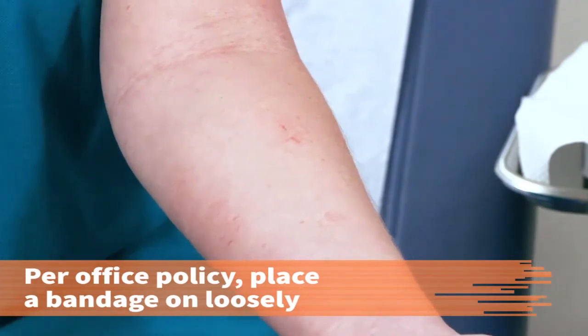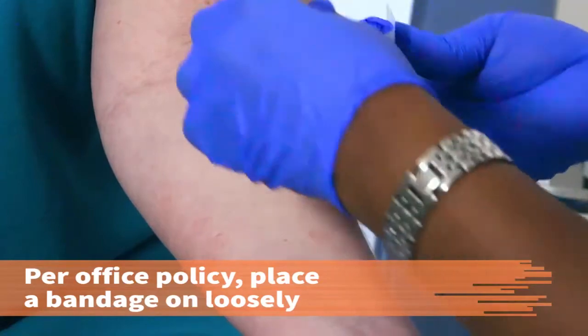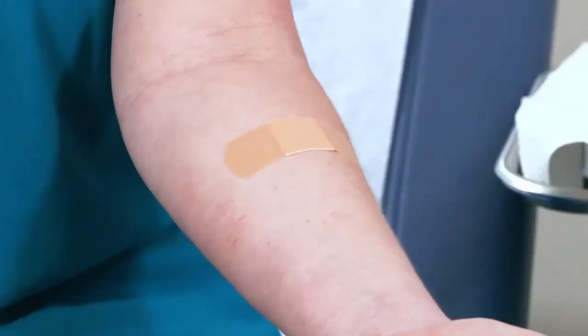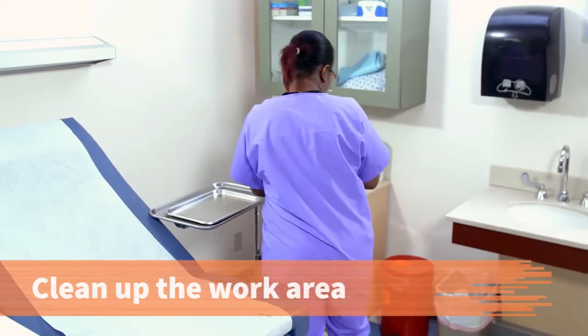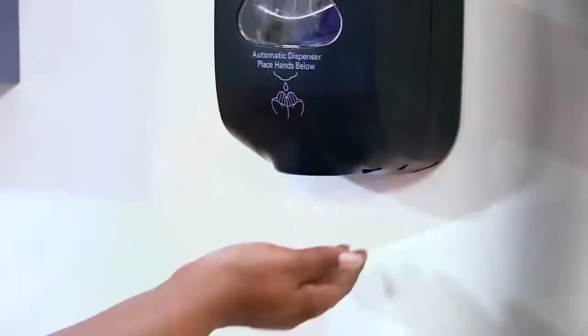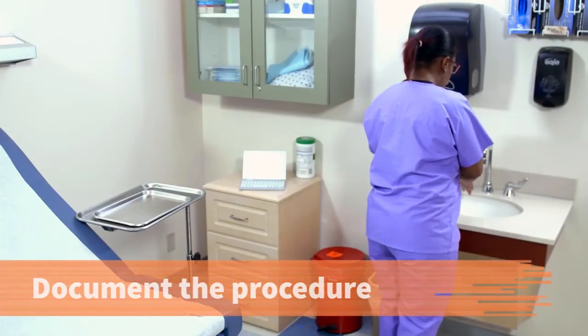Offer a bandage. Place the bandage on very loosely to just absorb any blood from the site. Some offices will not allow the use of a bandage. Observe the patient for any adverse reactions. Clean up the area. Discard all waste in the biohazard waste container. Sanitize your hands. Document the procedure in the health record.